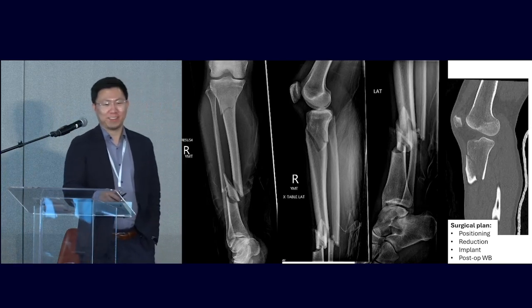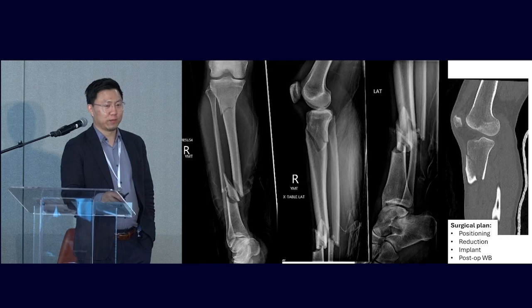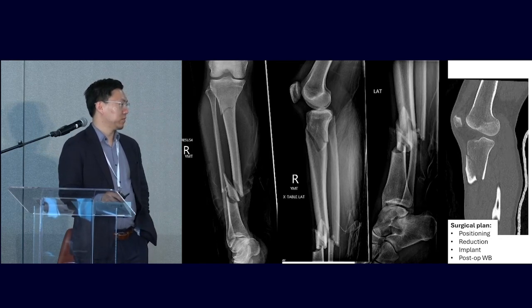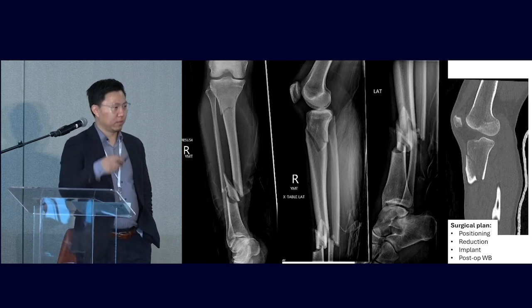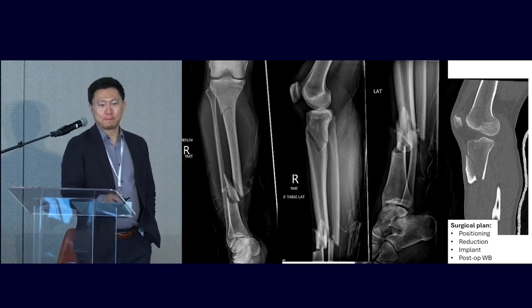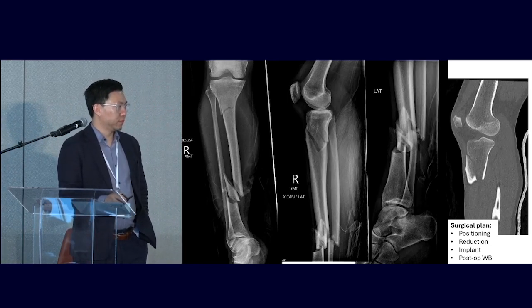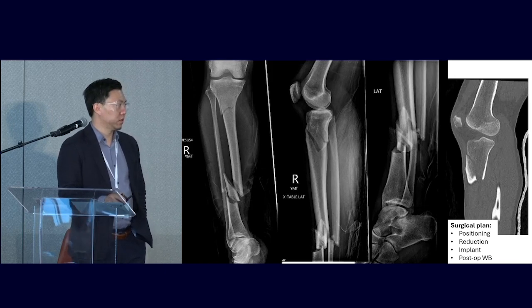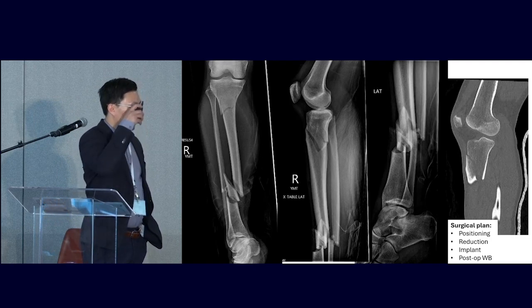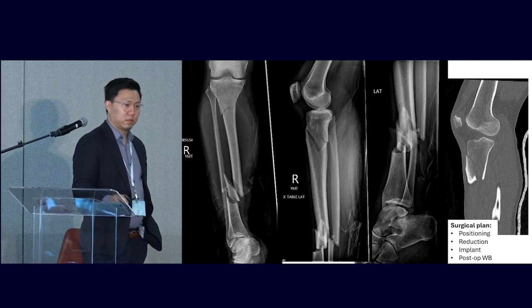I do a plate for the proximal part, but then nail down for the distal shaft. Because you could put a plate on and put just unicortical screws just to get control over the proximal segment, leave your canal open, and then fix the distal one. I just think this is an extremely difficult nail. It's going to be hard to get both of those perfectly reduced, unless I do it in a stepwise fashion. Going stepwise means I can put on the provisional plate proximally and then still put a nail down.